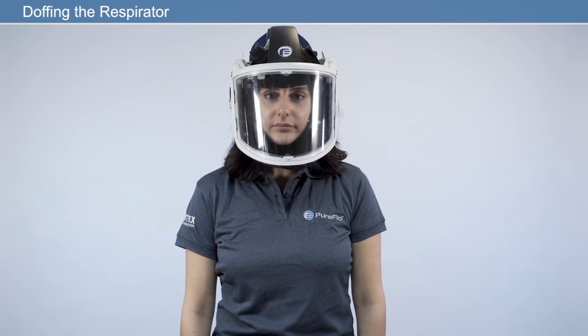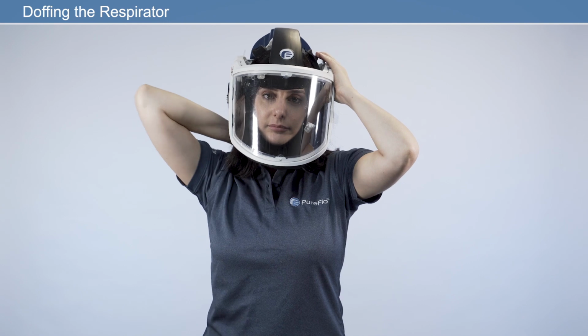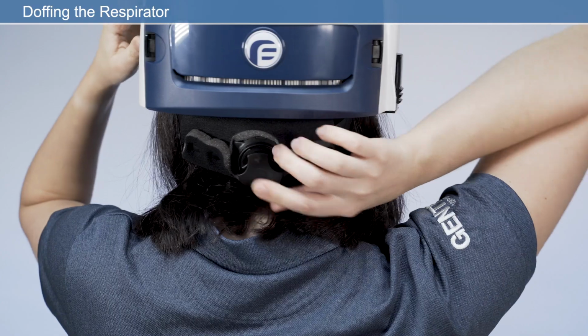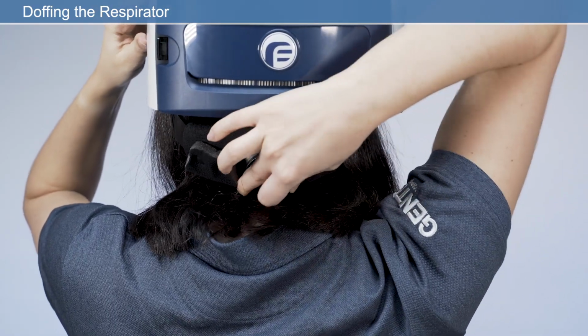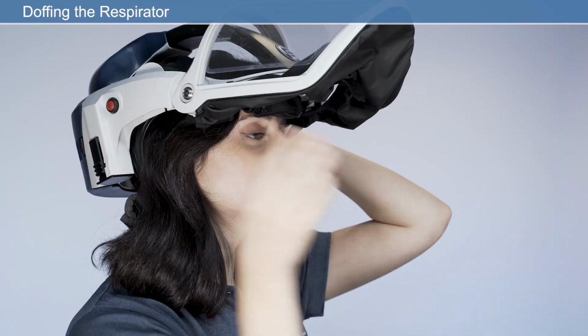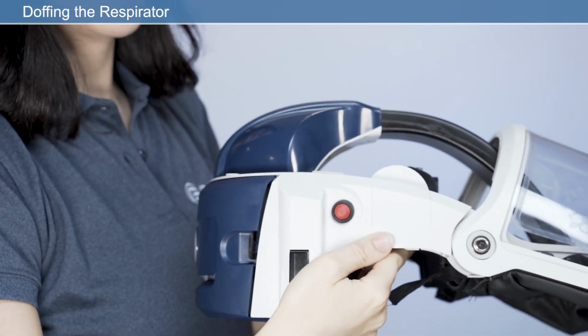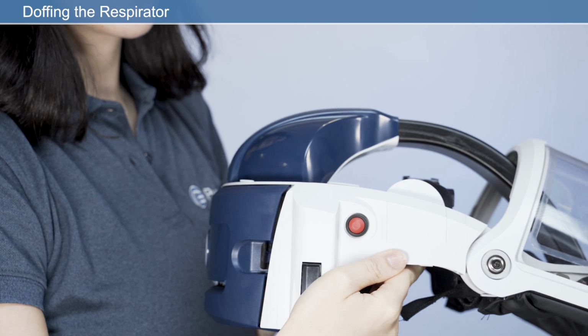Doffing the respirator. Before taking the respirator off, loosen the quick-release headband by pressing the ratchet button and simultaneously rotating the ratchet counterclockwise. Pull the face seal away from the chin to allow easy removal of the respirator. Remove the respirator. Press the on-off switch to switch the respirator off.